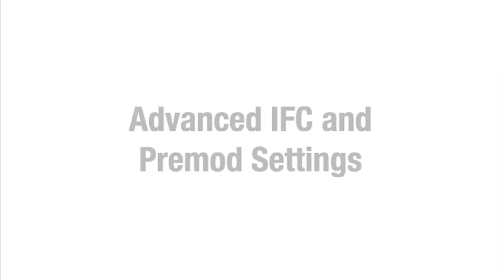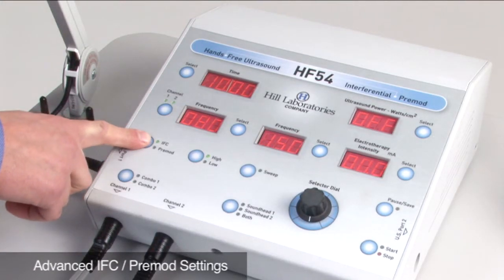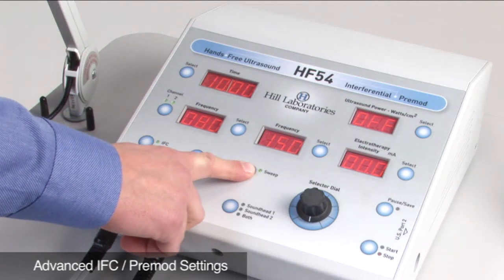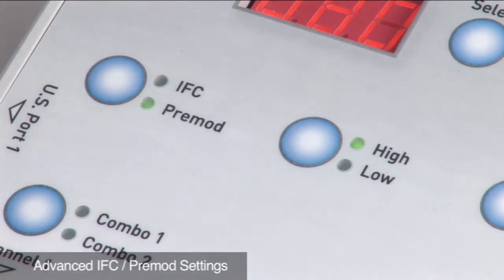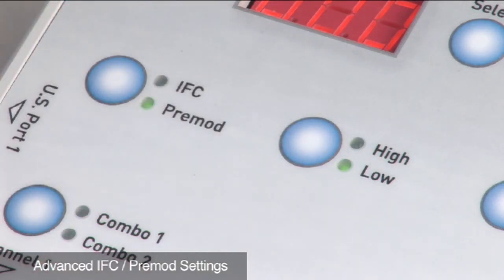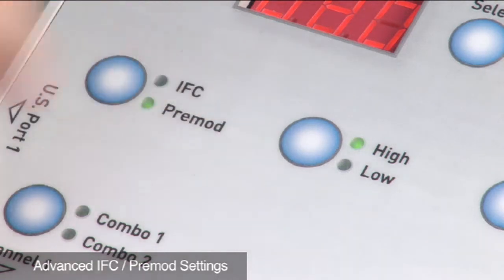Advanced settings can be set with interferential and pre-mod current. For interferential, selecting the sweep button will create a spiral sensation that covers 75% of the area within the electrodes. A low setting changes the frequency from 0 to 10. When high is flashing and low is lit, the frequency will change from 0 to 10 and 80 to 150 in 30-second intervals. When high is lit and low is flashing, half the time will be in low and half the time in high.